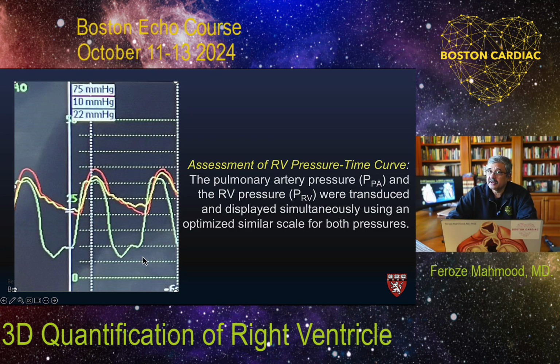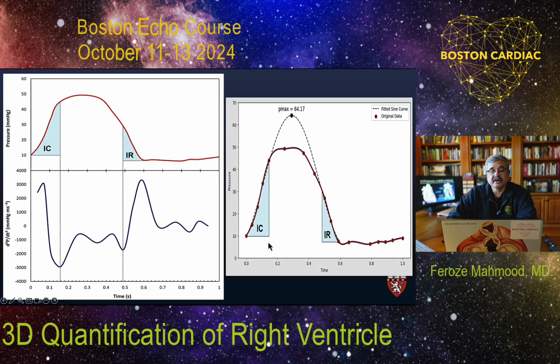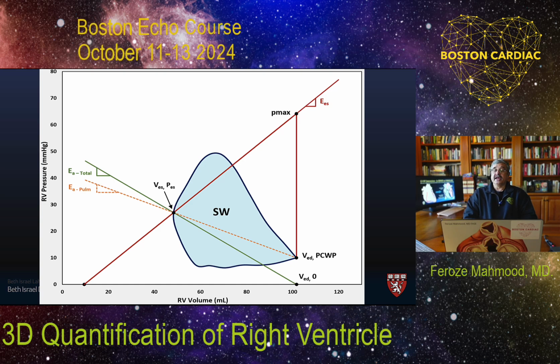based on the EKG, now we can draw what we refer to as a pressure-volume relationship between the increase in the pressure and the decrease in volume to generate a right ventricular pressure-volume loop in real time, near real-time generation of a right ventricular pressure-volume loop, with no isovolumetric contraction and relaxation, as you can see physiologically. As the time is decreasing, the pressure is decreasing, and the volume changes at the same time in the right ventricle, and you tend to have a triangular pressure-volume relationship. We are soon going to publish these results from our group.